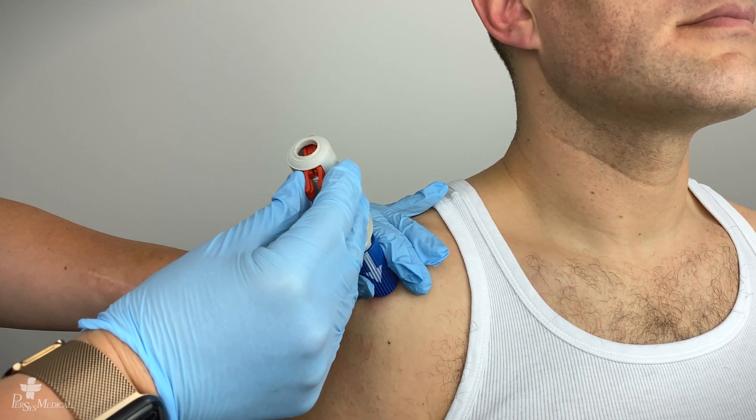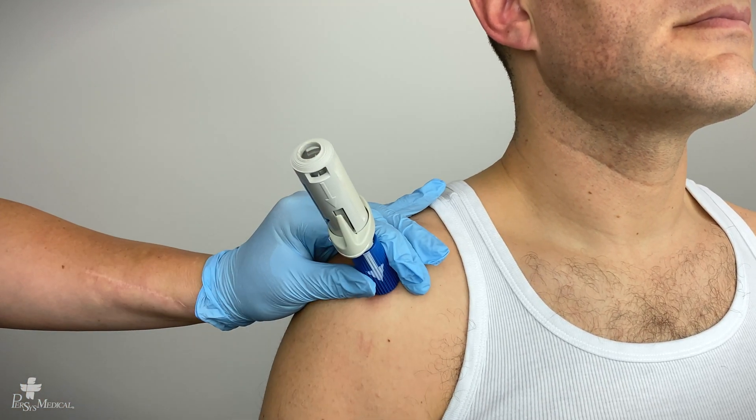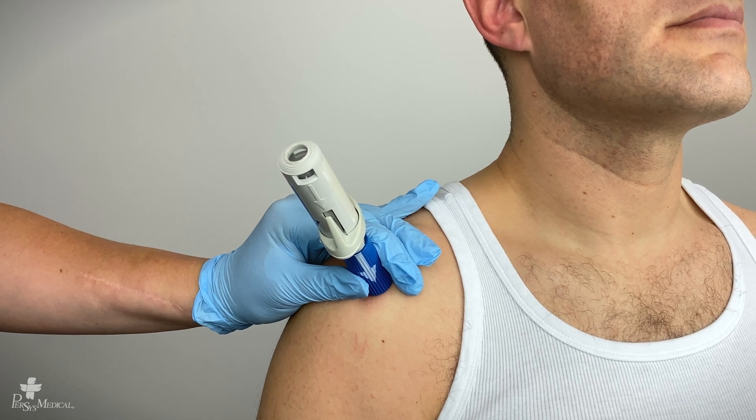Squeeze and pull out the red safety latch. Do not discard the red safety latch.